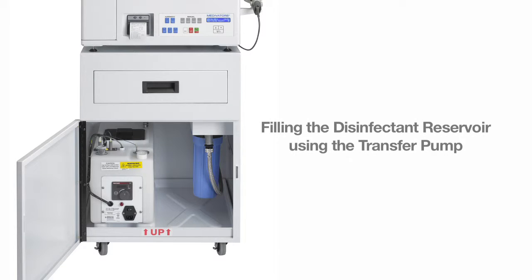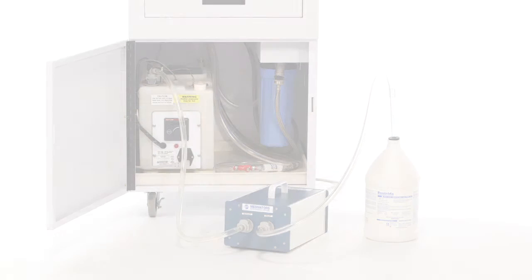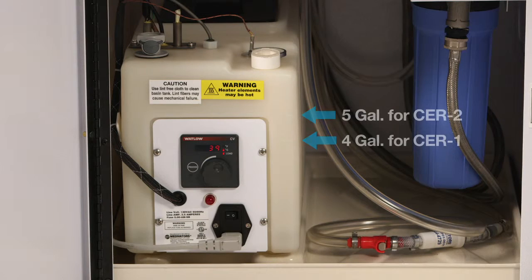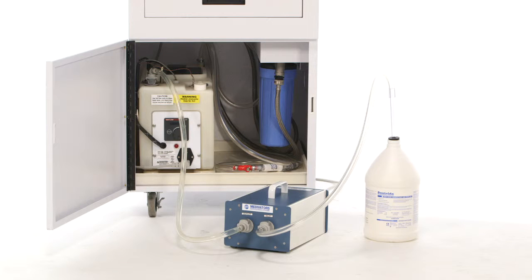Now we will demonstrate filling the disinfectant reservoir using the transfer pump. With the heater turned off, attach the CPC quick-connect tubing from the pump to the special quick-release fitting on the front of the disinfectant reservoir. Put the pointed end of the tubing into the disinfectant container. Plug the transfer pump into a standard outlet and turn the pump on. Continue to fill until the reservoir is full. After the transfer has been completed, clean the pump using clean water pumped into the sink, and then air in order to flush out the pump before storage. Attach the transfer adapter to the end of the outlet tubing to open the valve and prevent the tubing from bursting.